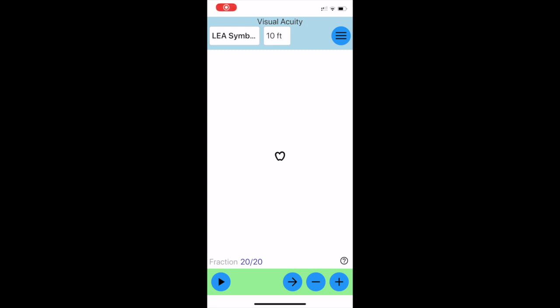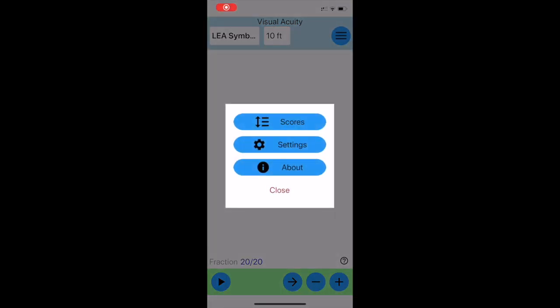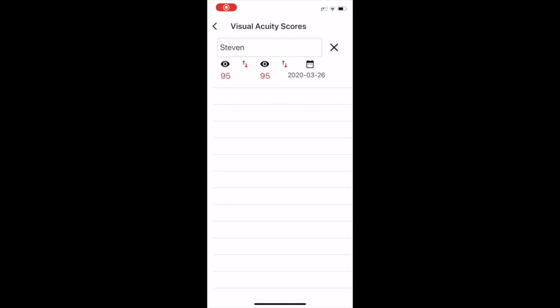To recall the left eye and right eye values, press the top right hand button, then press Scores.